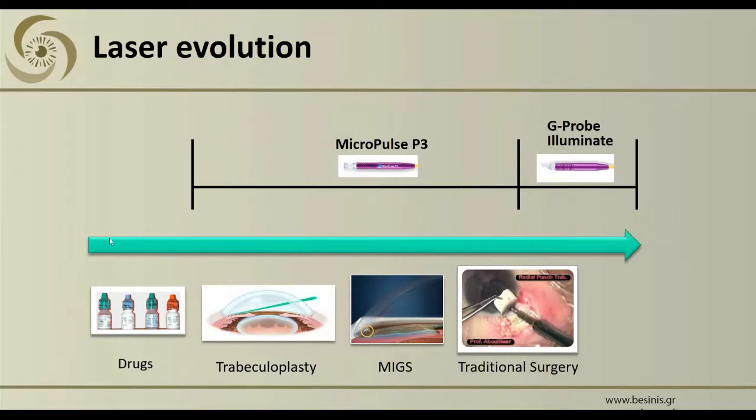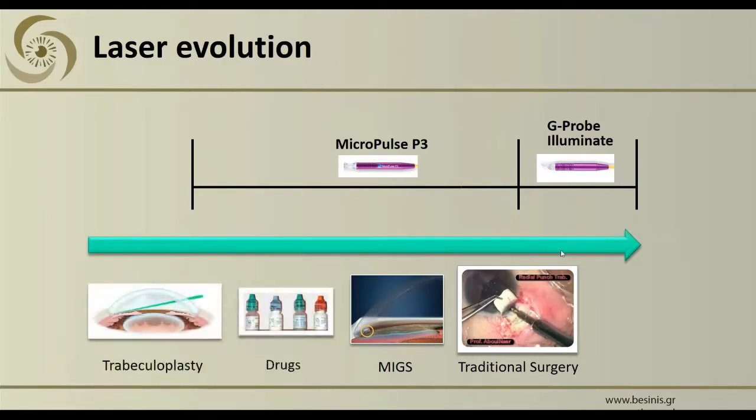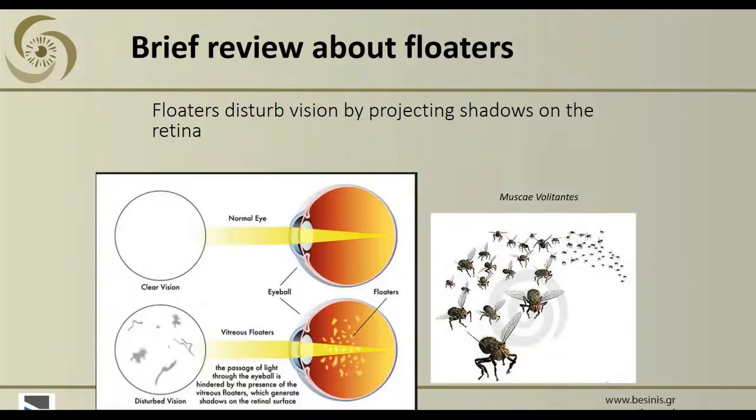This is how things have evolved, and I do believe that eventually, and this is what I'm doing now, this is how things are considered for treating glaucoma. So I do have laser trabeculoplasty as the first option, first line treatment. It has replaced the drops, a PGA or a timolol. And so this is one aspect of the treatment that you can have with the Selecta Duet.